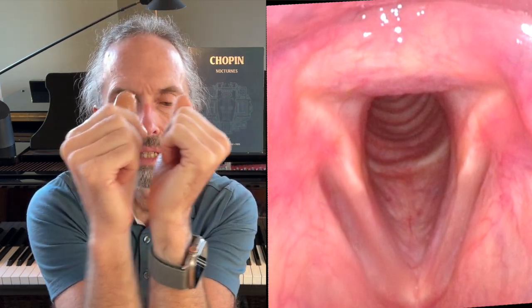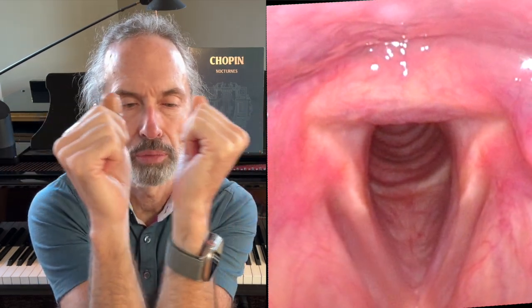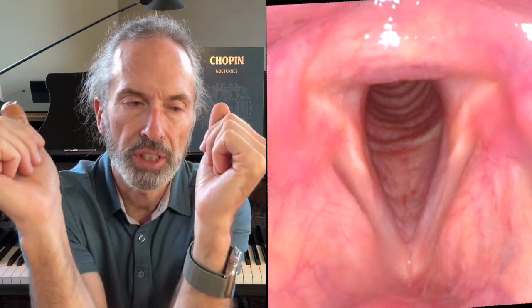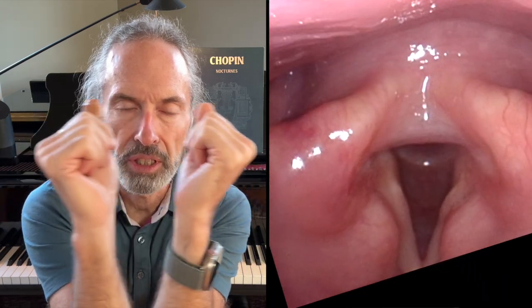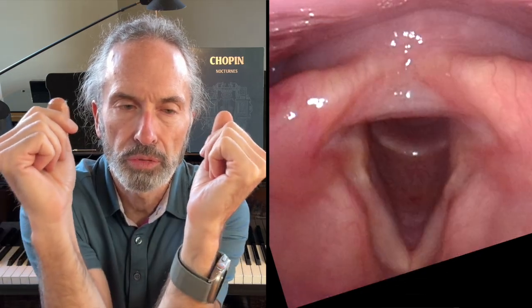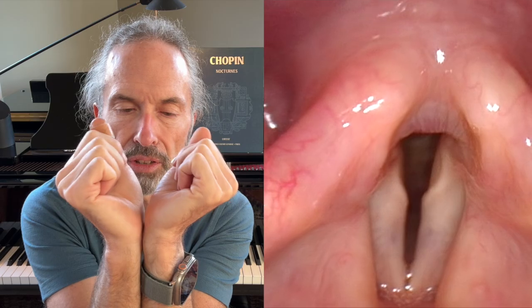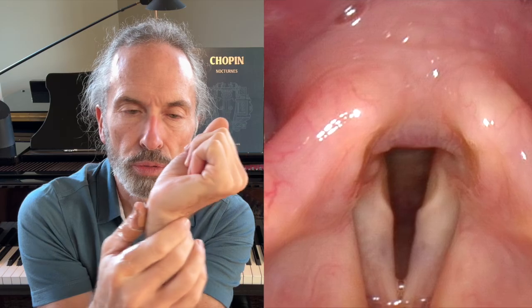So during breathing, the vocal process is going to move. In general, when you breathe in, they open up, and when you breathe out, they close partway to resist airflow. But they do more than one thing. There's translation, that is, the vocal process moves from lateral to medial with each breath. But there's also rotation of the joint, and that is when the joint moves medially, it rotates inward, so that's expiration. And when you breathe with inspiration, the joint rotates laterally. So there's translation and there's rotation.